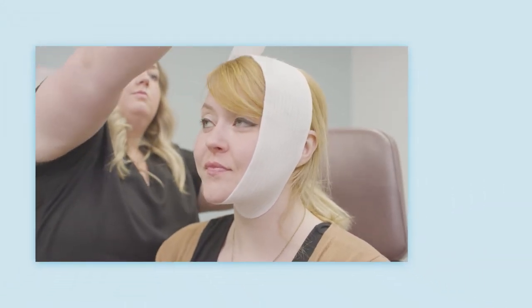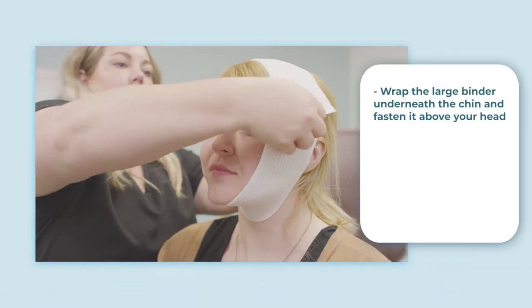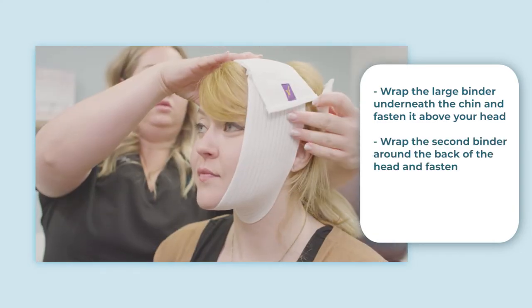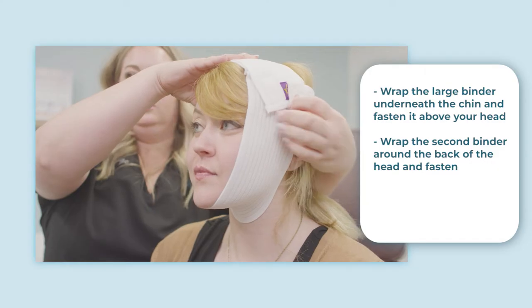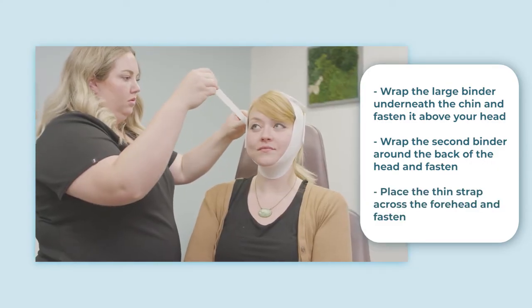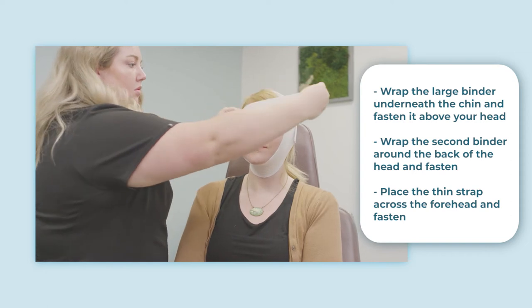First, wrap the largest binder around your face from underneath the chin and fasten it in place using the velcro. Next, wrap the second binder around the back of the head and fasten it to the first one on both sides. Then place the thin strap in the front across the forehead and fasten it on both sides as well.